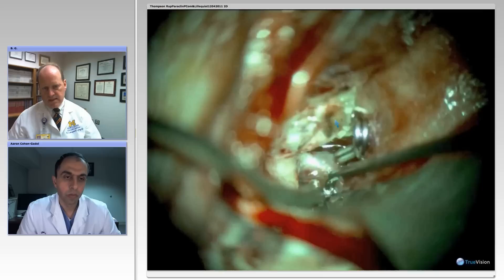The dome is still adherent to the third nerve, so I'm going to leave that for now. And then I look medially to see both the PComA and the perforators. There's the PComA and the perforators off of the PComA.